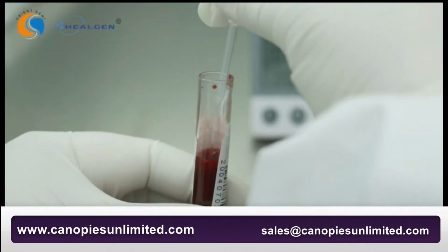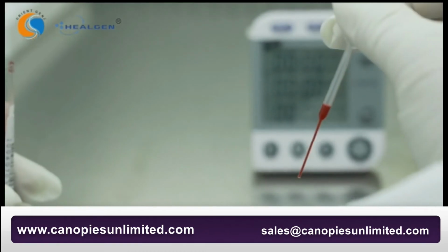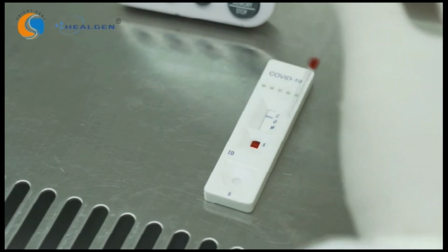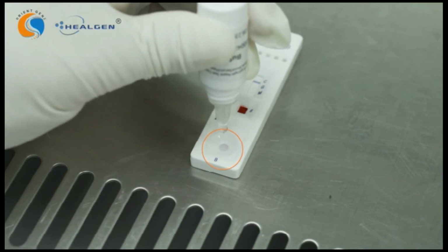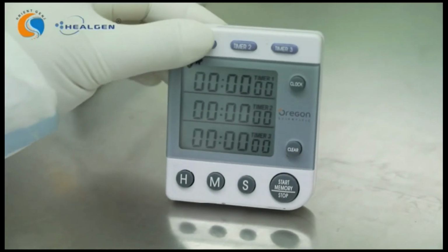For whole blood specimen, draw the specimen into the dropper. Hold the dropper vertically and transfer 1 drop of whole blood to the sample well. Then add 2 drops of buffer to the buffer well immediately after. Start the timer.